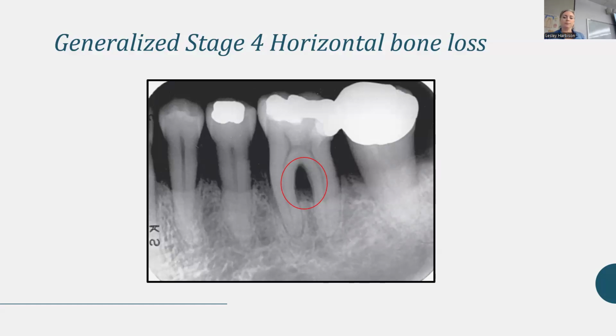So when we look at this picture, obviously, this is an extreme; you're well below the coronal third. One way you can train yourself to do this is to print out an x-ray, or pull one up on your iPad, and draw a horizontal line at the CEJ, as horizontal as makes sense. Then find the apex and break the root length into thirds, visually, over and over again. You can start to just see it.